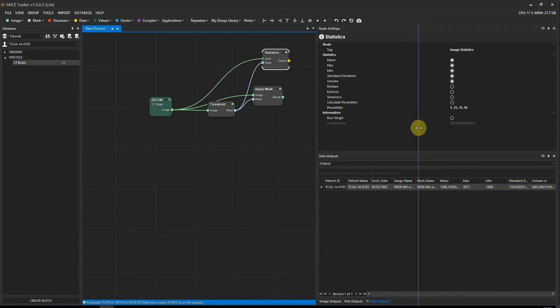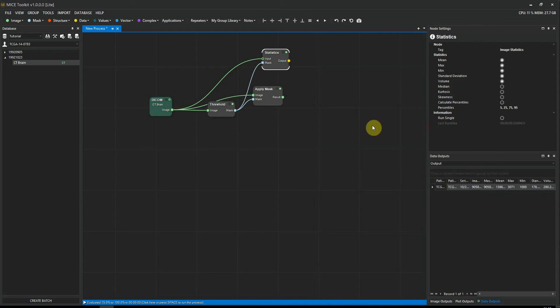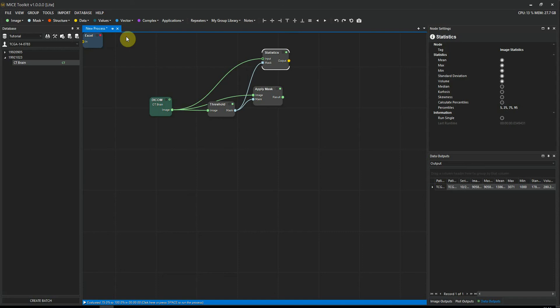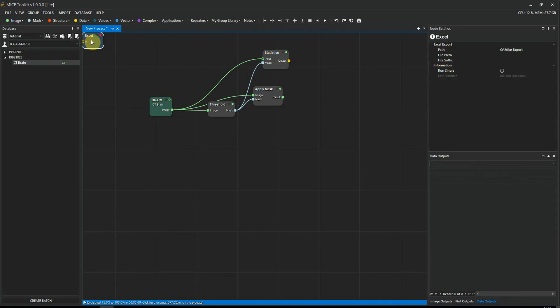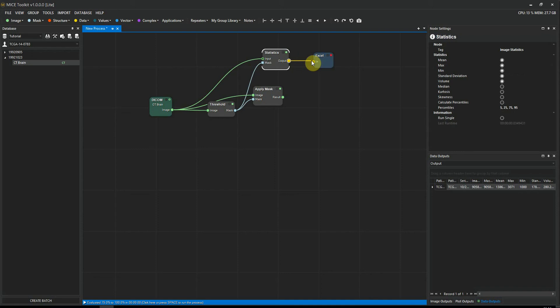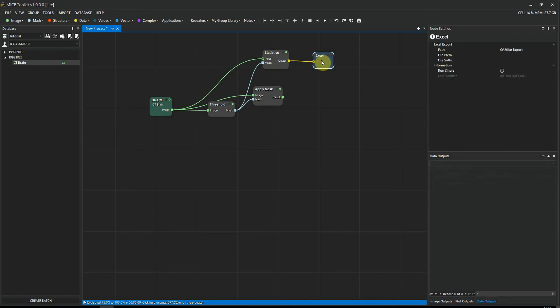Now I want to export this to Excel, and I can do that by going to data, export, Excel. This export node takes one input, so I connect the output from the statistics node to the input of the Excel node. In the node settings of the Excel export node, I can select the path to where I want the file to be stored. Press spacebar to execute the workflow.